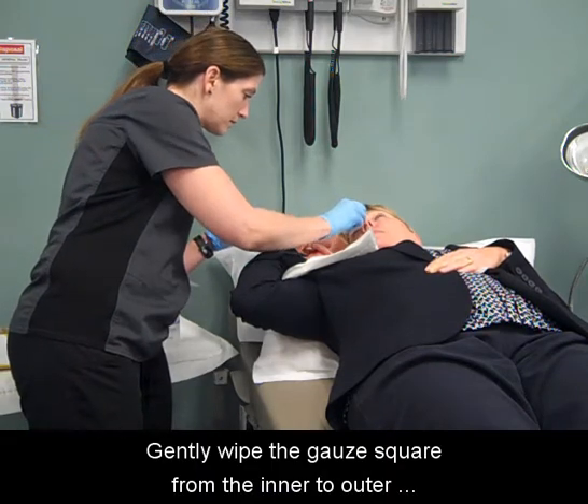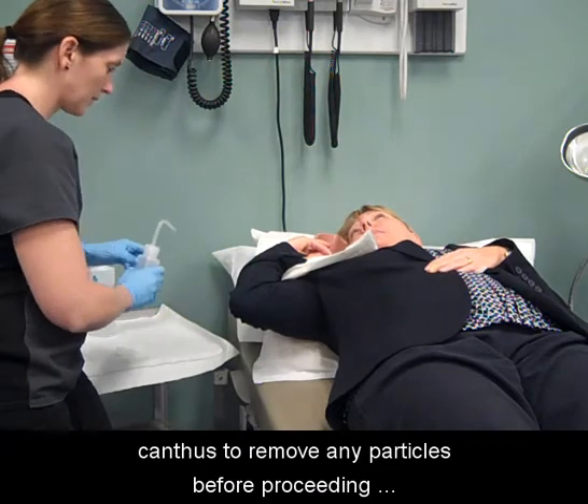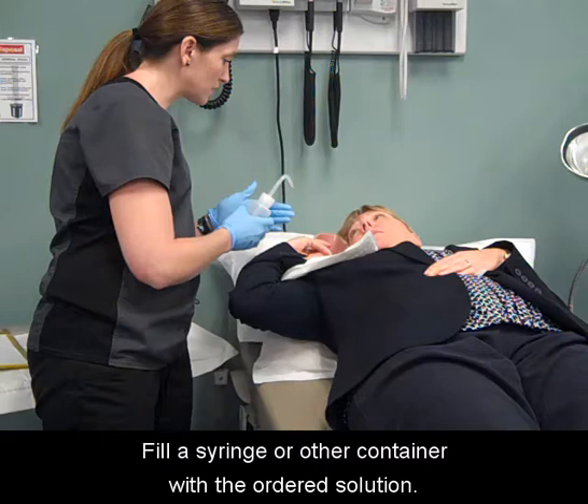Gently wipe the gauze square from the inner to outer canthus to remove any particles before proceeding with irrigation. Fill a syringe or other container with the ordered solution.